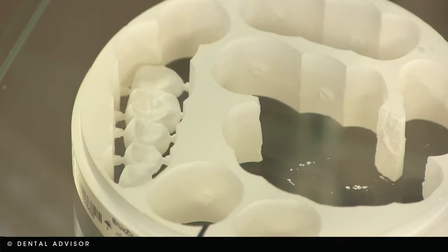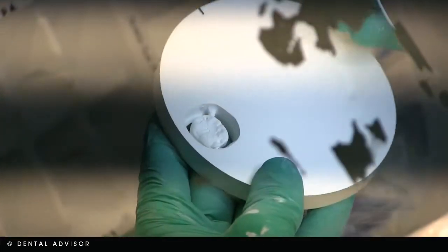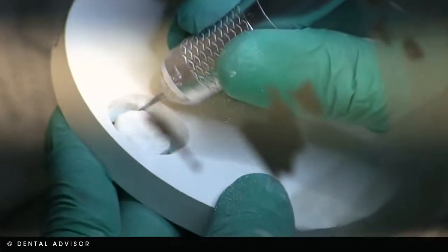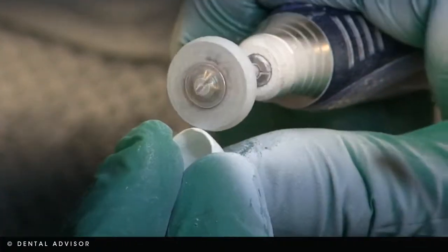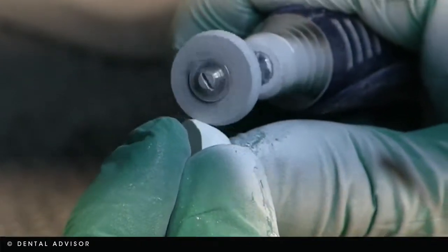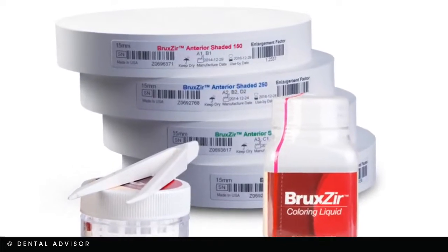Compared to the milling unit in my office that uses a small block, you have these pucks that can do many units at one time. Exactly. So under the microscope, they remove what's left — similar to how we cut the sprue on our units. We might have 20 units milling out of one puck, so they all have to be cut out, the sprue smoothed off, and each unit re-identified by shade, since we only sinter certain shades together.